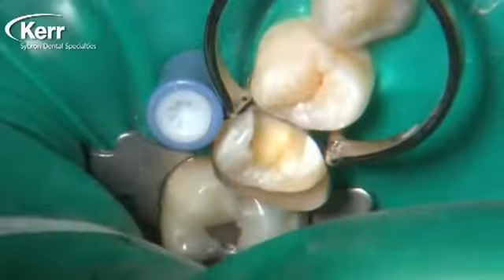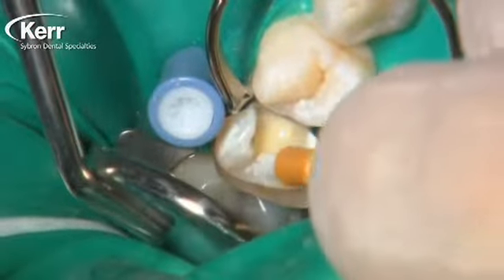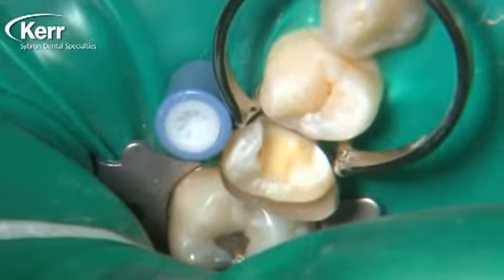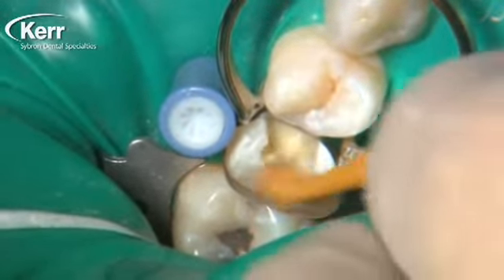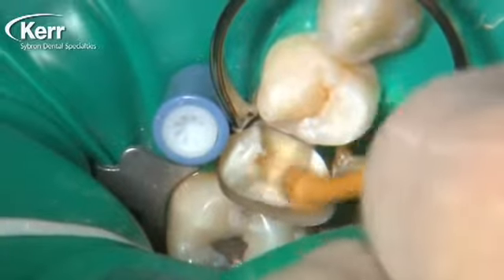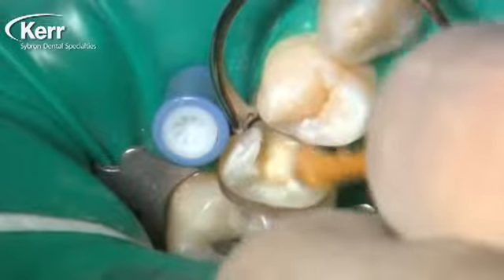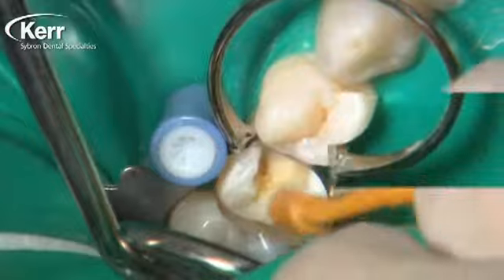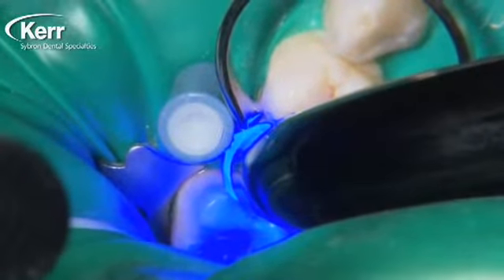We fill about a third of the preparation with the Vertice Flow, then use the enclosed brush to thin the material and move it up the cavity wall preparation towards the enamel margin. We're spreading it all around, thinning the material while coating the entire inside of the preparation. We really want to cover all the tooth structure — whether it's dentin or cut enamel — with the Vertice Flow, getting it down to a layer that's about half a millimeter thick.